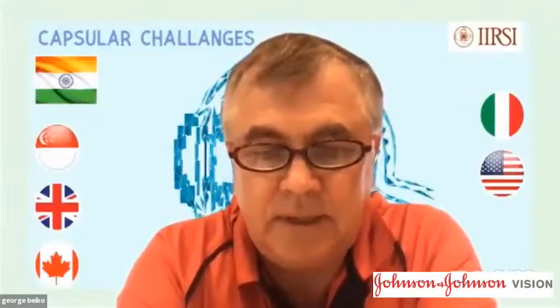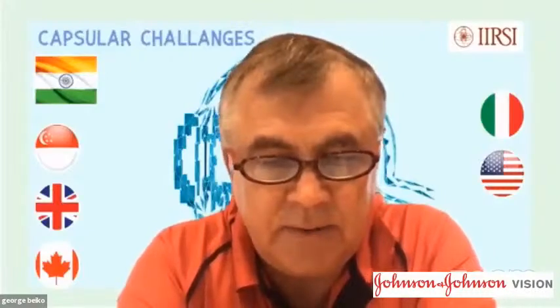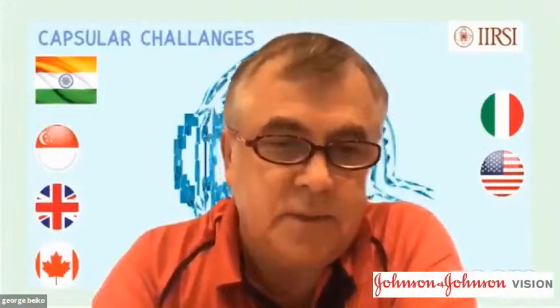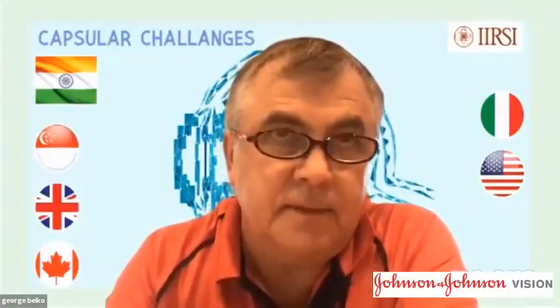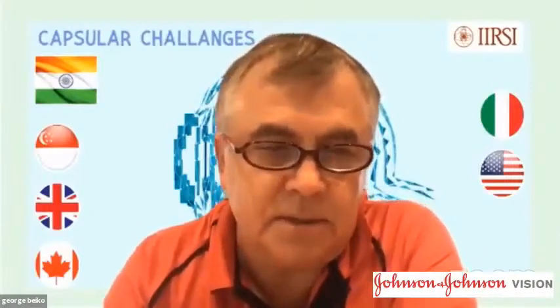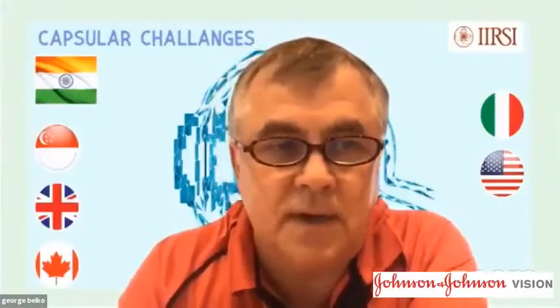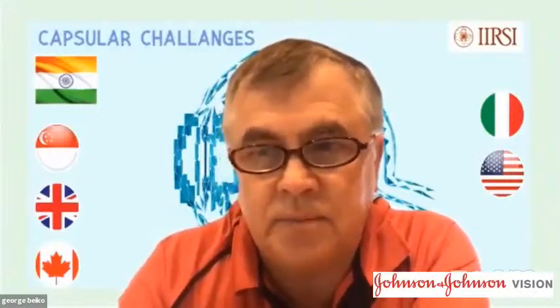Once I have my capsulorhexis, rather than use a tip to milk the liquid from the mid periphery or from behind, I've had situations where the initial reaction is to go in and see if you can use the phaco tip to remove that plaque. It does show that you have to remove that manually before you go in and do your phaco emulsification. So I think it's a very important point.